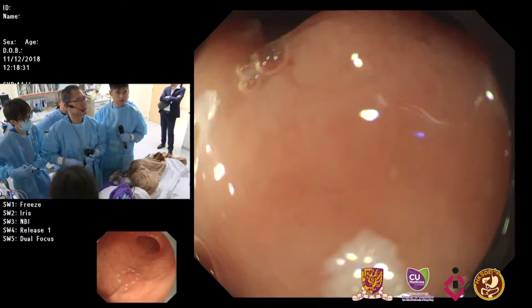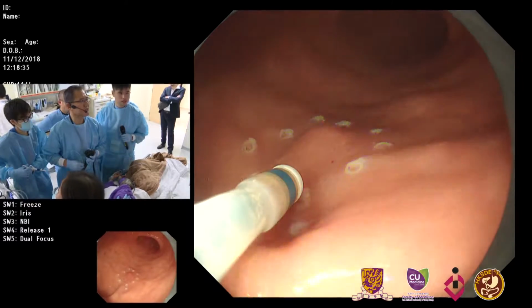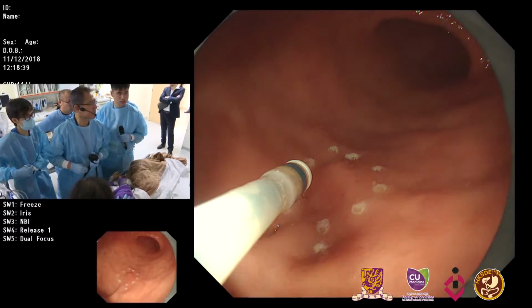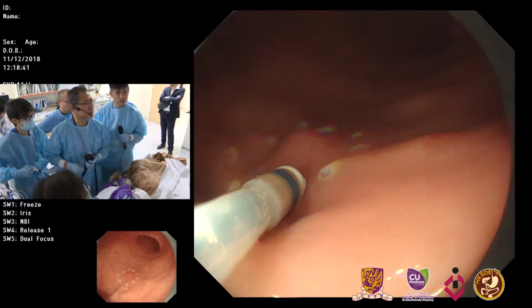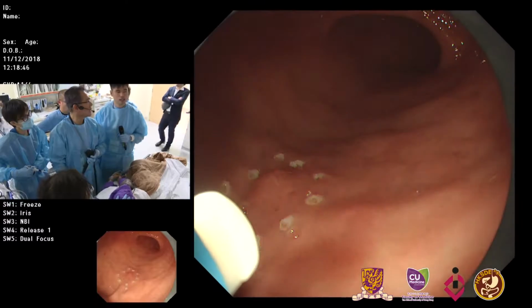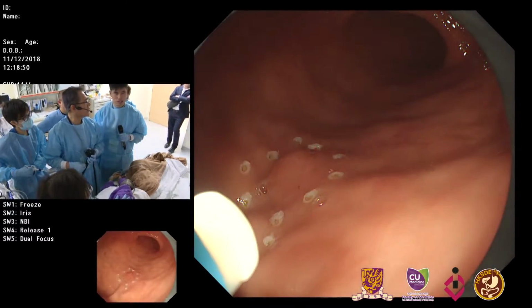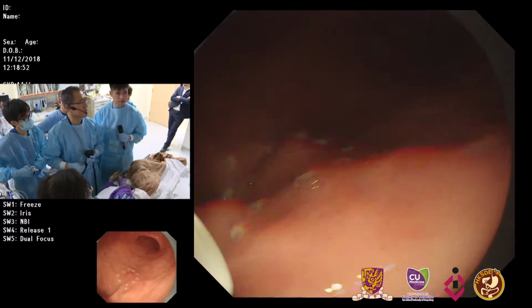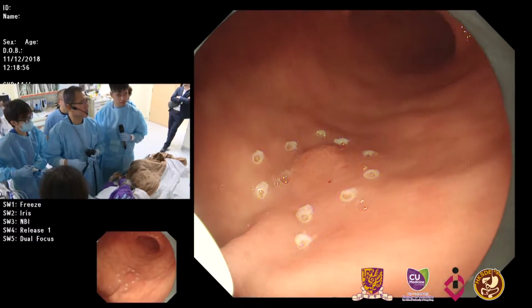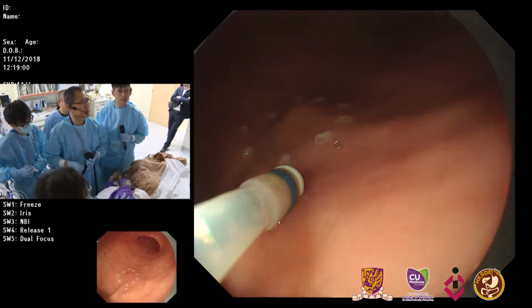If we'd like to know a very narrow space in order to compare with the histological specimen, we always put an additional marking just at the edge of the lesion. So between the 2 marks, we exactly cut the specimen and make the section. So it can tell us a 1-to-1 correlation. So it is another idea. But this region does not need such close correlation. This is why I put 2 markings on the oral side.